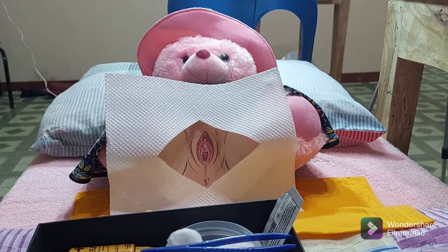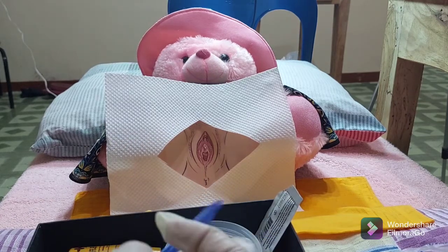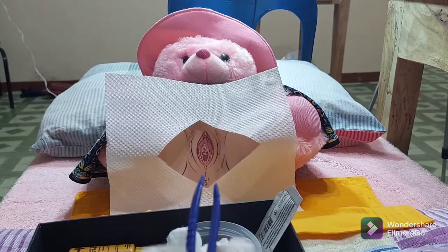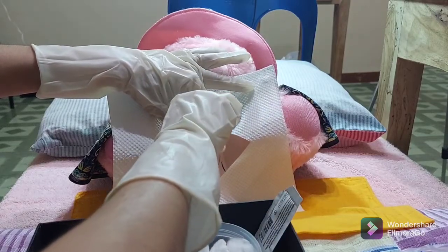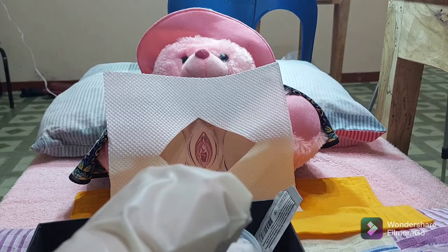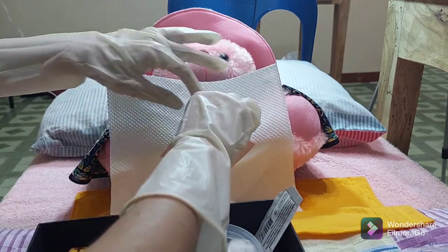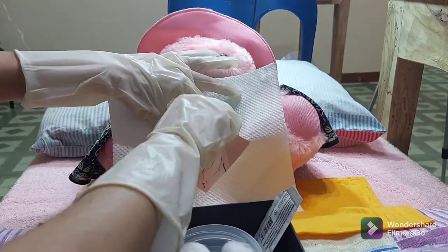In female patients, separate the labia with the fingers of the non-dominant hand. Using sterile technique and the dominant hand, clean the labia and urethral meatus from clitoris to anus. Then discard it. And from outside labia to inner labia folds and urethral meatus. Then discard it, and the other side.